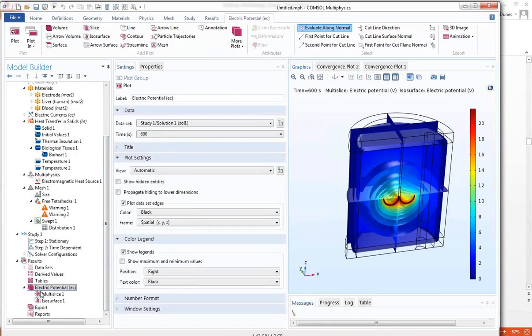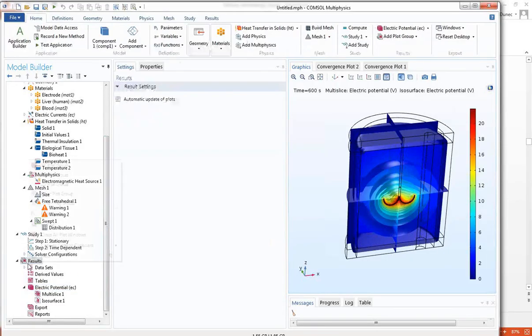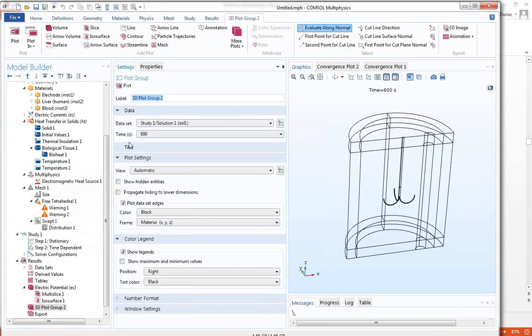And it looks like it's happy. Okay, so now let's go ahead and look at this electric potential. I want to add yet one more 3D plot group. I'm going to do this fairly quickly. I'll just leave it that name, right click.